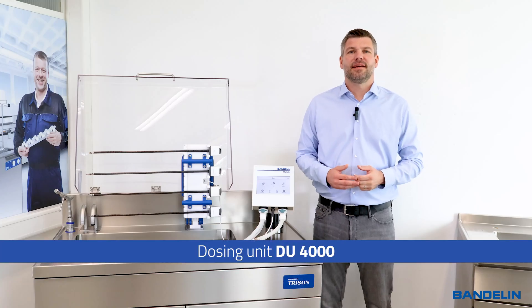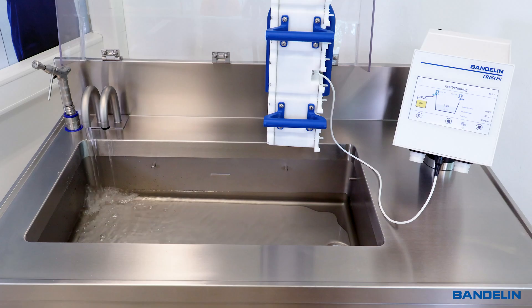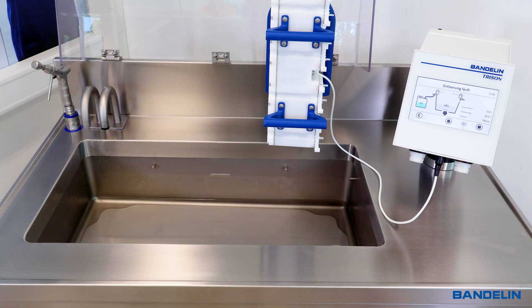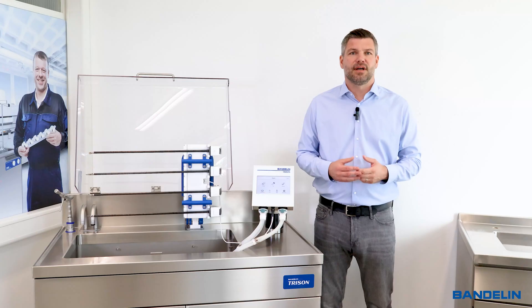The integrated dosing unit enables automatic filling with water and cleaning agent and automatic emptying of the ultrasonic oscillating tank. A built-in fill level sensor prevents accidental overfilling. The unit is operated via the touch display on the base.